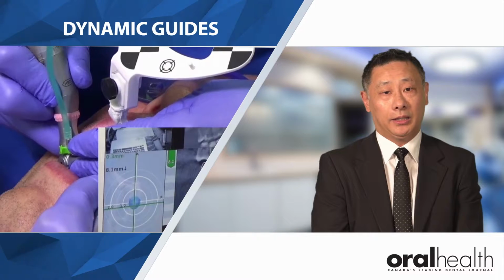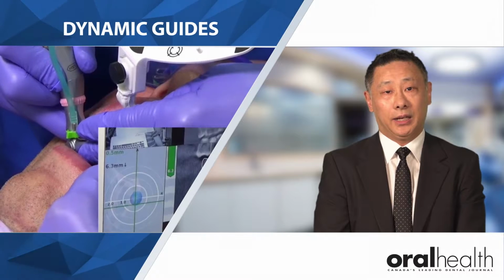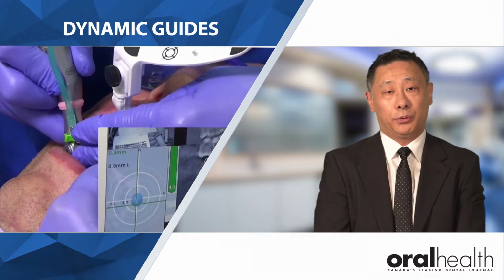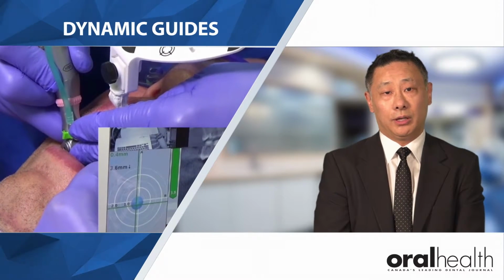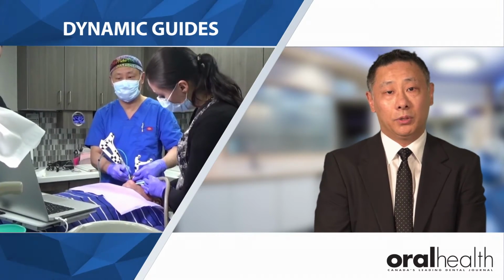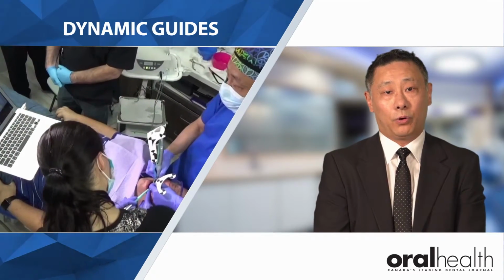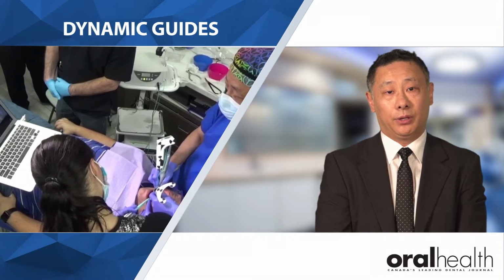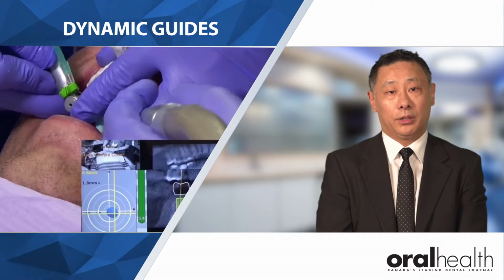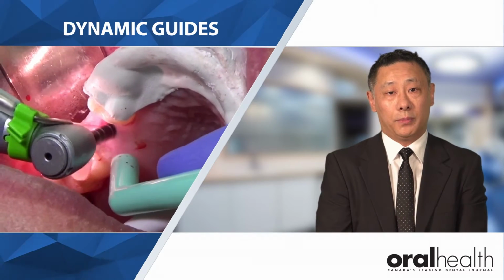Finally, the dynamic guides. With the dynamic guides, what we would utilize is, again, a patient scan imaging of a cone beam and computer treatment planning, so that we, again, appreciate the three-dimensional anatomy or challenges that we have to run into. And then essentially, the clinician will be doing the implant surgery while looking at a monitor, which gives us the information for the depth, the angulation, and position of the implant. If you will, some of the orthopedic surgeons are utilizing this, where the surgeons are looking to a scope or looking at a monitor rather than in the patient's mouth.